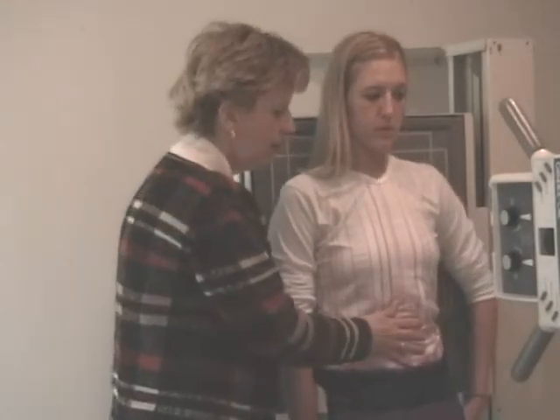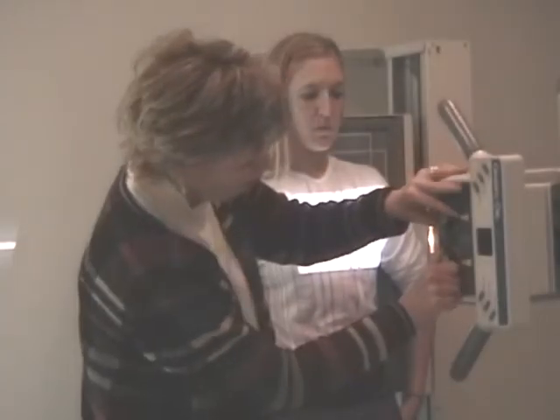So the lower ribs, which is our focus, 9, 10, 11, and 12, they don't come around, so they just get closer to the film. And we would change our collimation to the 10 by 12.